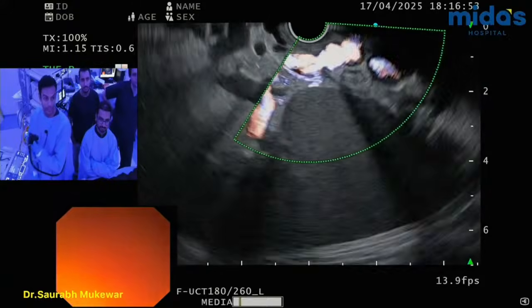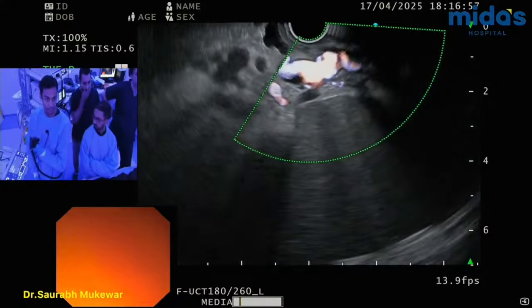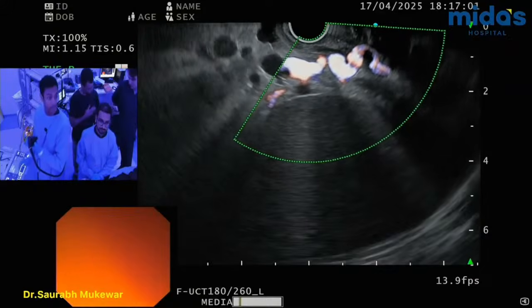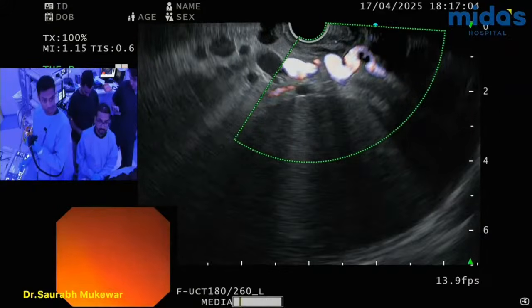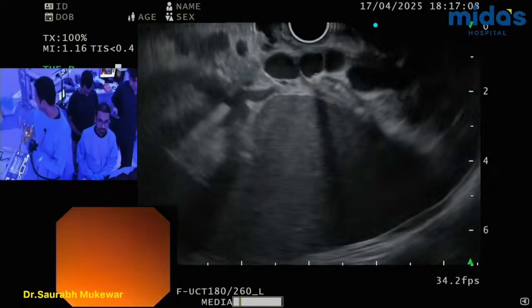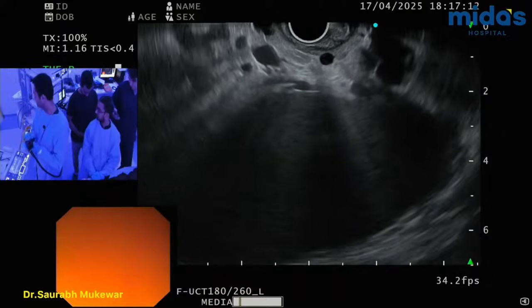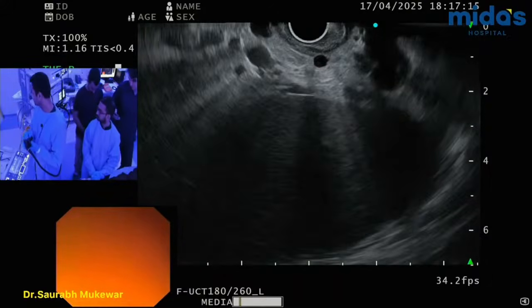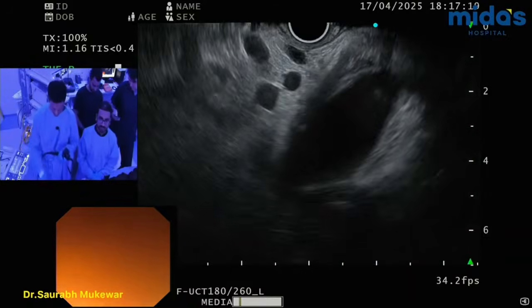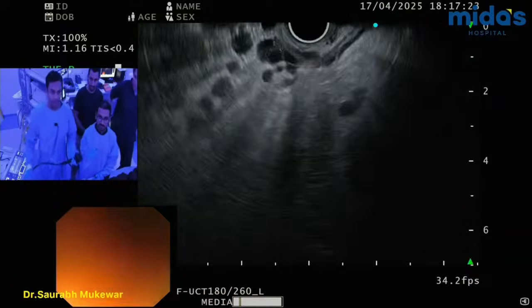Okay, ready, guys? Pulse now. Okay. Load the needle with the coil ready. Ready. Where's the nail? What will I do? Tell me what he's saying. Wait for her to come.